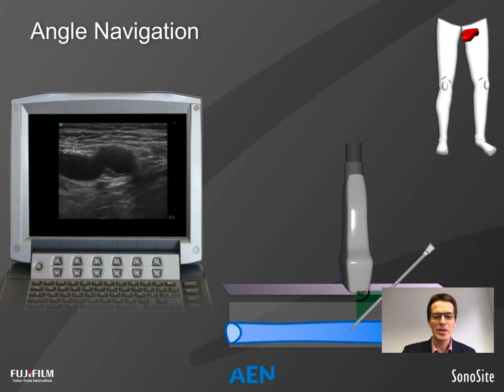However, as we said, rather use it for superficial structures and for vascular access. In deep structures, it is quite easy to understand that the errors of using the wrong angles actually get greater and greater. So what methods do we have to improve this situation?